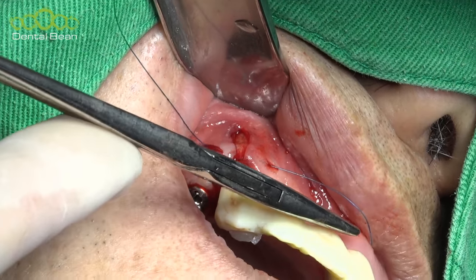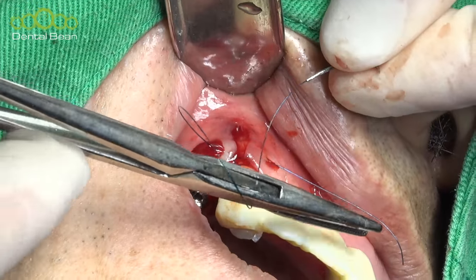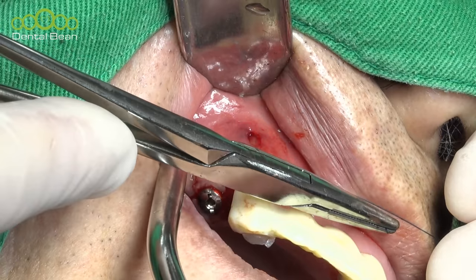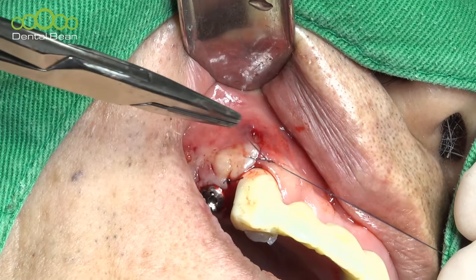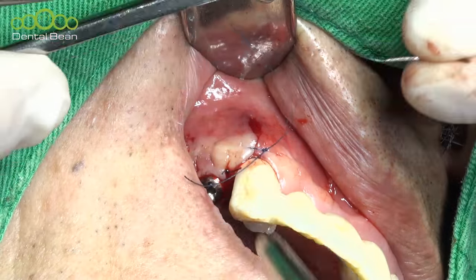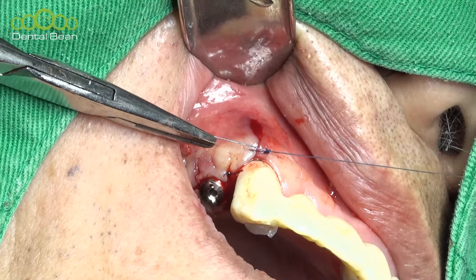At this time, please make one turn. Two turns sometimes jeopardize this situation. One turn and then very careful tension here. And then reverse. Two more. Just the four is okay at this time.